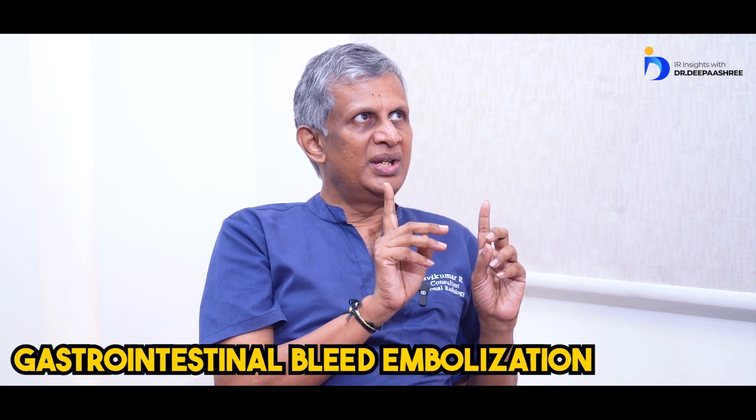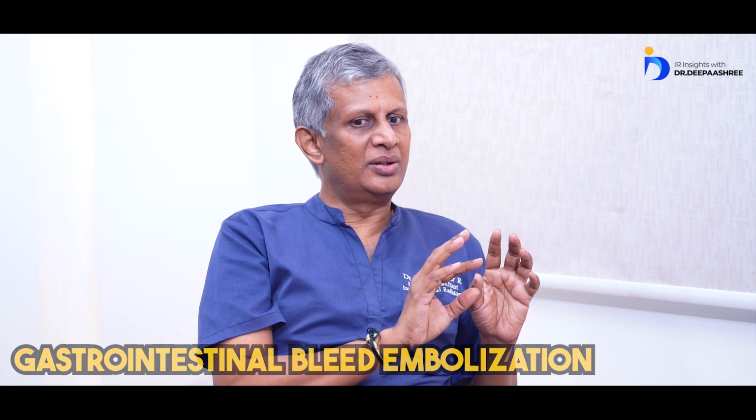Again, when you're choosing GI bleed embolizations, never try to do more than 3 vasa recta. If you embolize more than 3 vasa recta, there's bound to be ischemia and infarct. So try to minimize the amount of vasa recta you embolize.